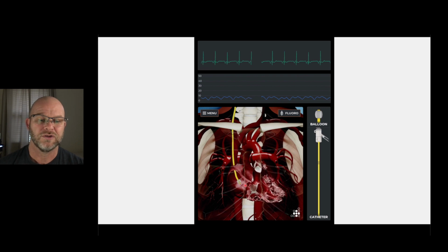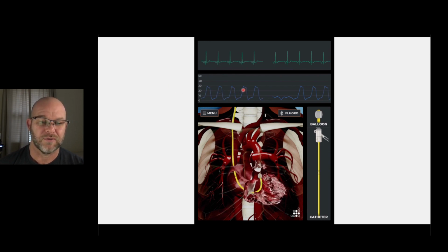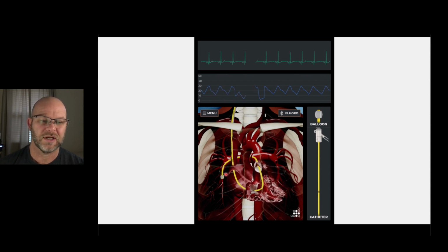The flow of blood is supposed to help float this balloon in the direction that you want to go. Here in the right atrium, we'll have a right atrial waveform. We go through the tricuspid valve, and now we see a distinct change to our ventricular waveform. Through the pulmonic valve into the PA, there's an arterial looking waveform. We'll go out and wedge in the pulmonary arteriole, and now it goes back to an atrial waveform. Why another atrial waveform? Because this represents the left atrial.